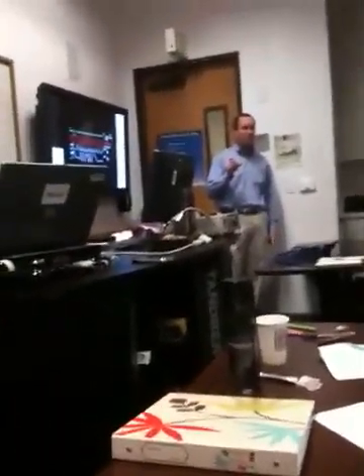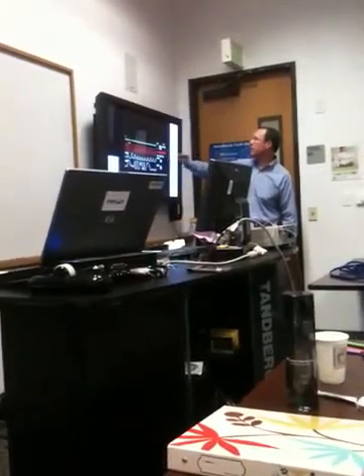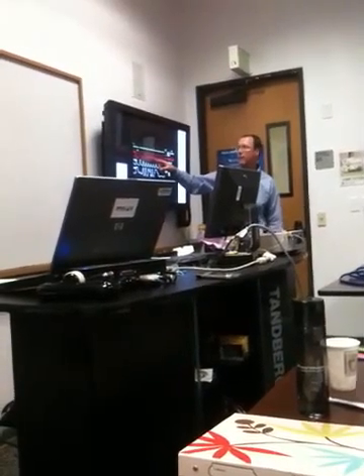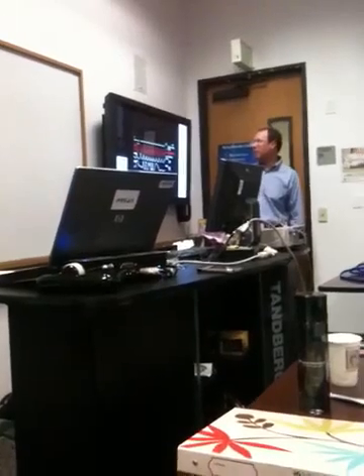Judging what the rhythm is, okay? So lead 2 here, this person's heart rate is 83, okay? And this red one, do you know what that is? The arterial blood pressure. This is their arterial blood pressure, okay?